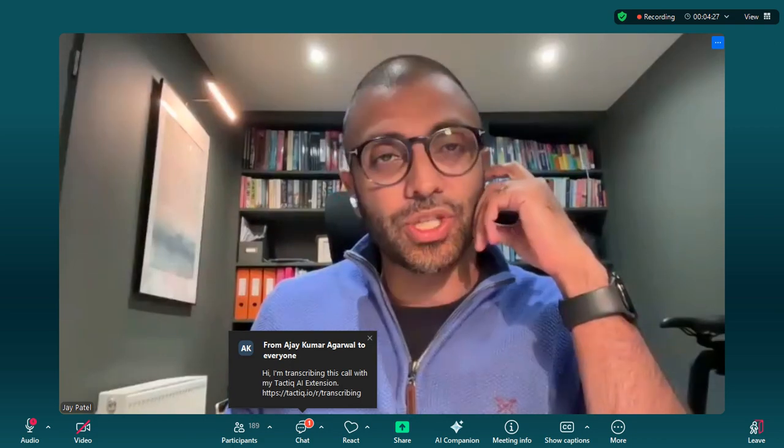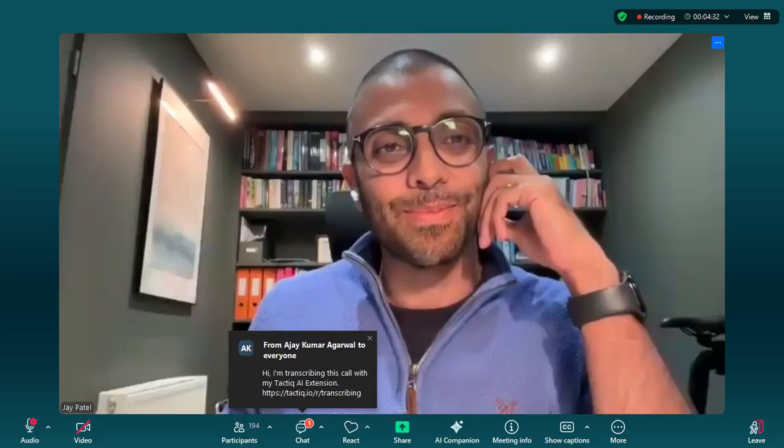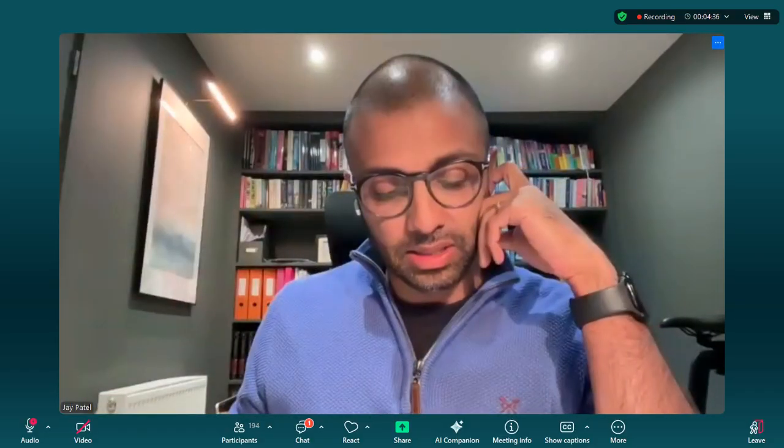So the aim is to go through three cases per candidate. We'll get through them sequentially. One of the things that certainly came from my experience of going through the FRCR 2B examinations is this quote or this standard of saying, typical presentations of atypical things or atypical presentations of typical things. And I'll be focusing on that as we go through the cases I'm presenting to you.